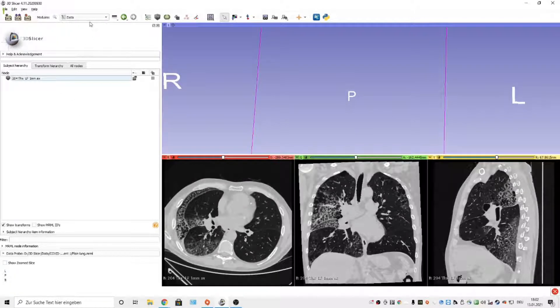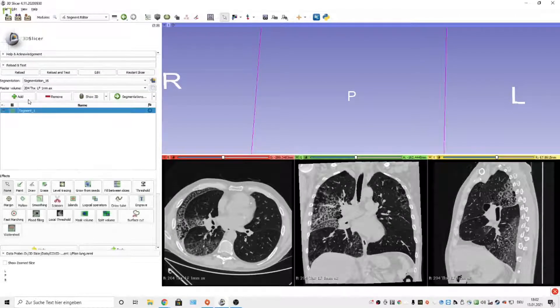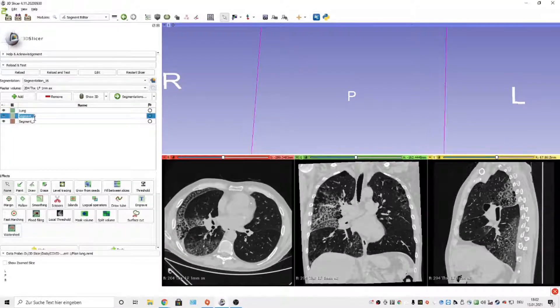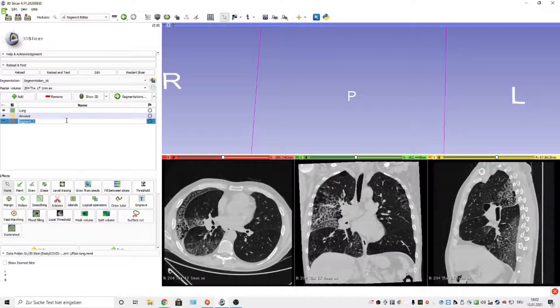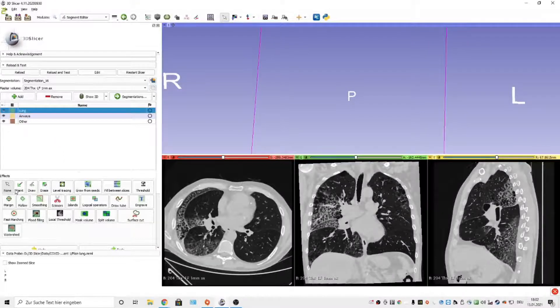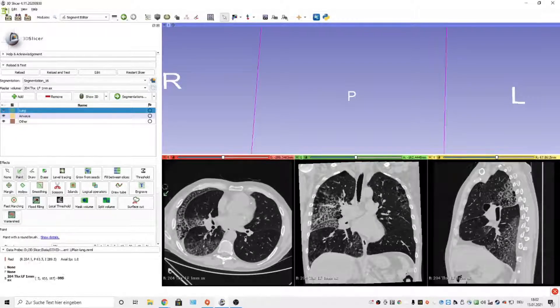First of all, I would call up the Segment Editor and create three segments. One is called Lung, one is called Airways, and one Other. Then I would select Lung, use the Paint tool and paint on the right and left lung in all axes.